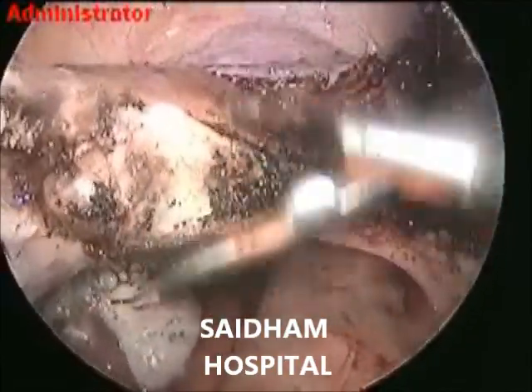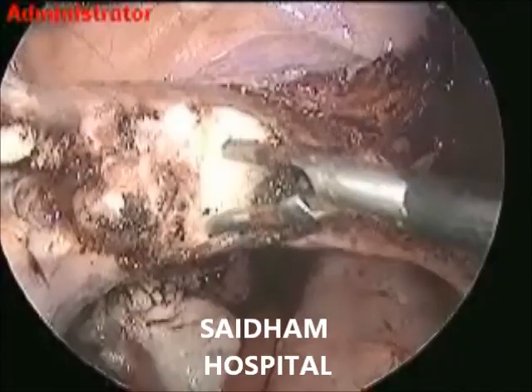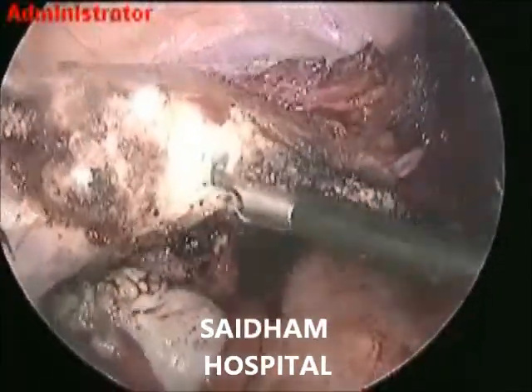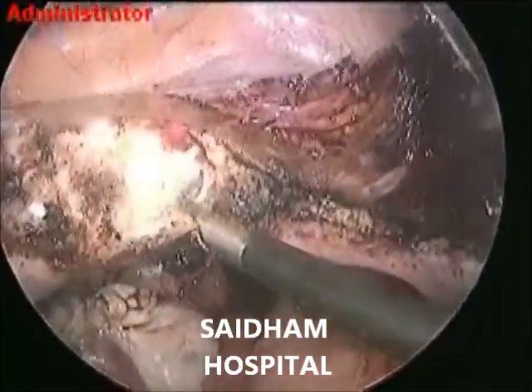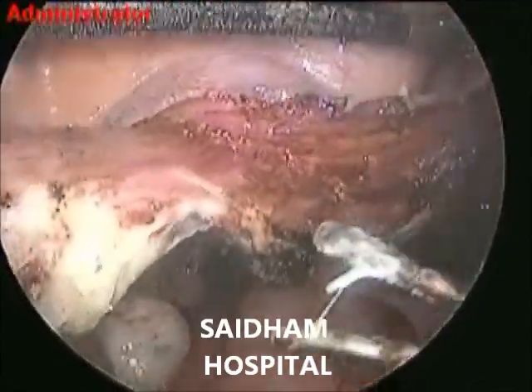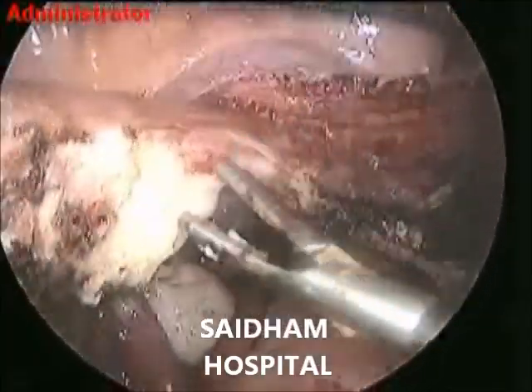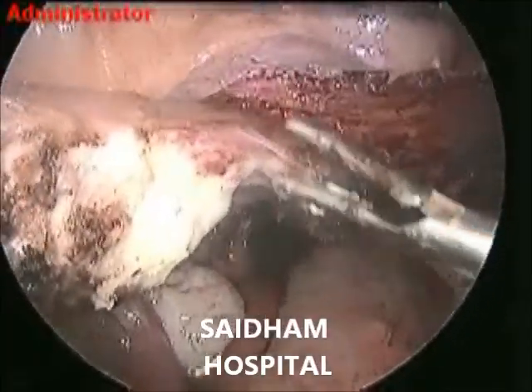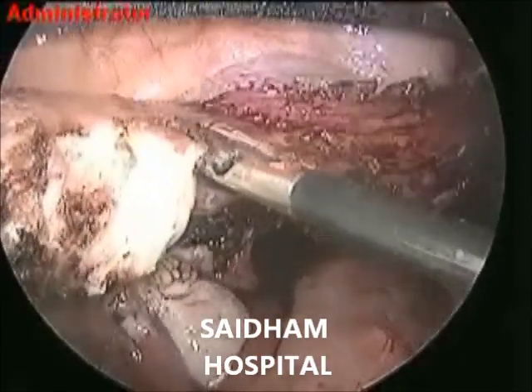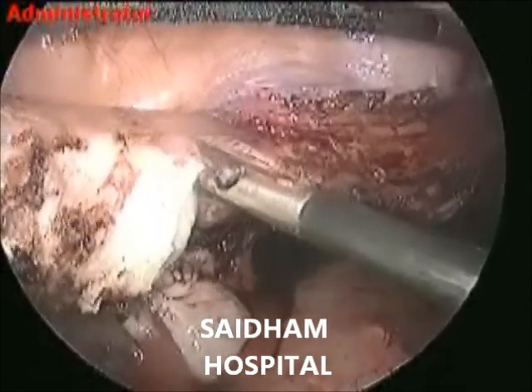Slowly cutting is going on in small bites in a single plane, until we get the vault — until we get cutting of vaginal tissue. Ultrasound is very poor indeed in endometriosis. Generally the MRI should be the best investigation if you suspect any endometriosis.